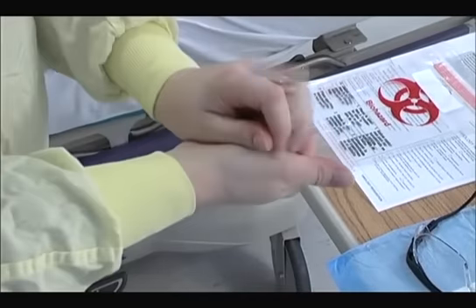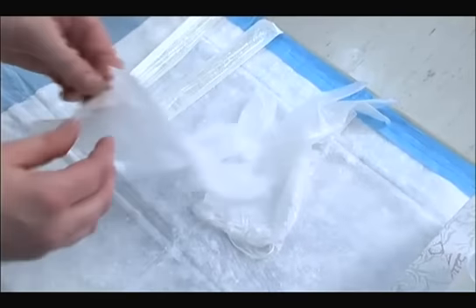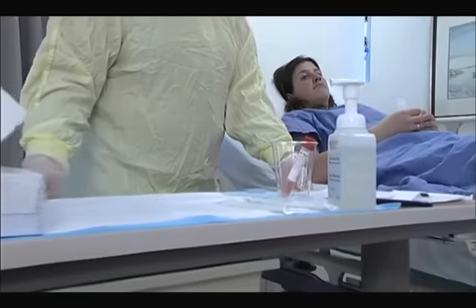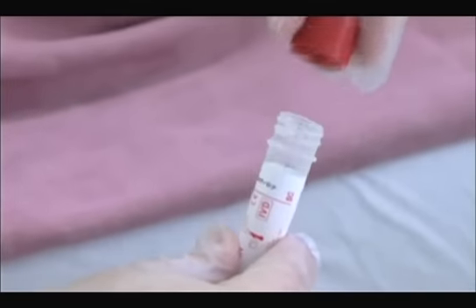Follow the infection prevention policy of your institution, which may require hand hygiene, a mask, protective eyewear, and gloves. It may be helpful to loosen the lid of the specimen container to facilitate putting in the swab after it has been collected.